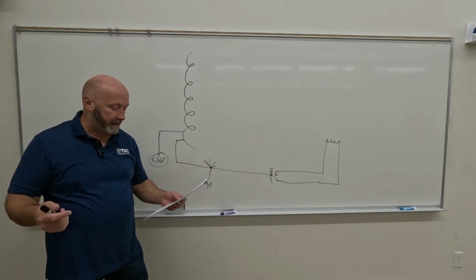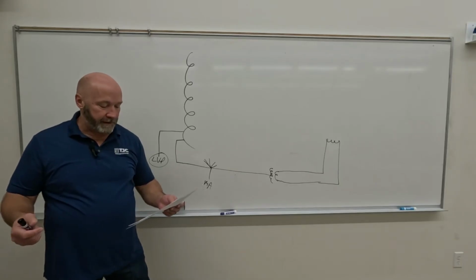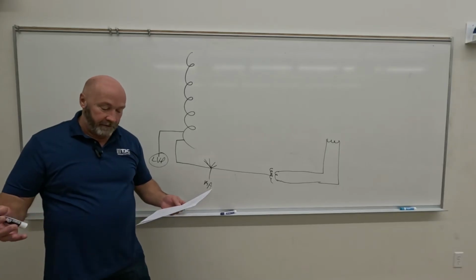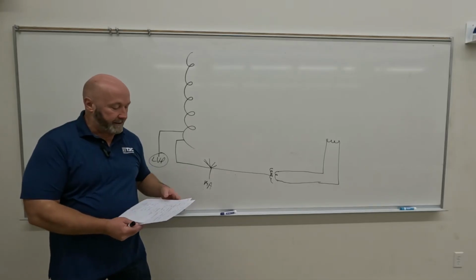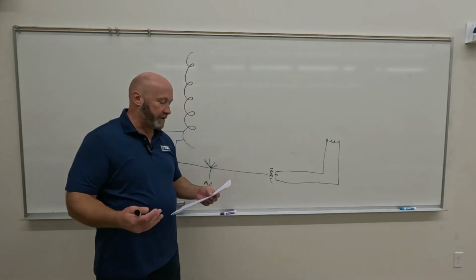And then we talked about electronic, which is the most common, and we get extremely short exposure times with that, as short as 1 millisecond. They're the most accurate, and we're going to talk about that a little bit deeper when we get into imaging. Most common, responds quickest, all the good things.